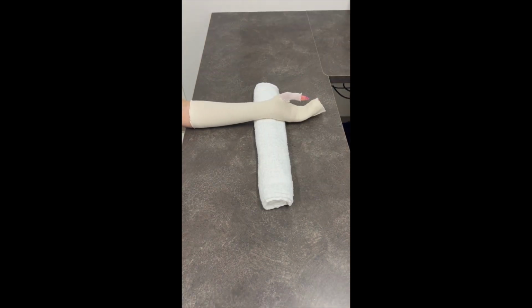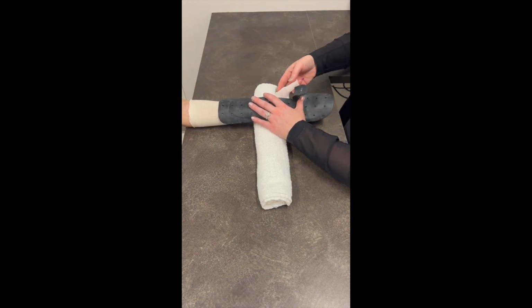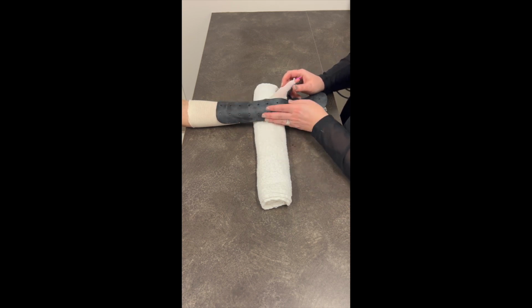Once your material is ready, then you can start fabrication. So we positioned the wrist on top of a rolled up towel just to allow slight extension of the wrist, just for easier fabrication. So we're going to line up the orthosis. And again, we're going to be positioning the fingers in a functional position.